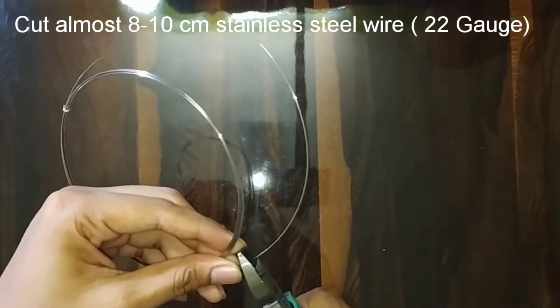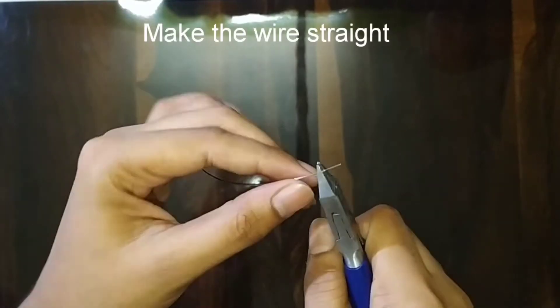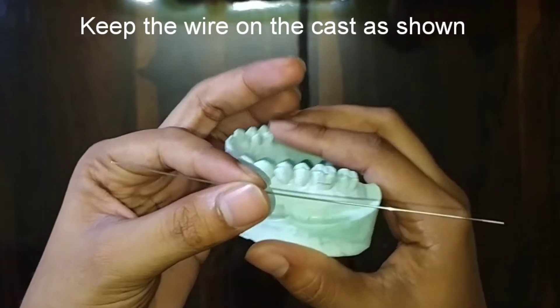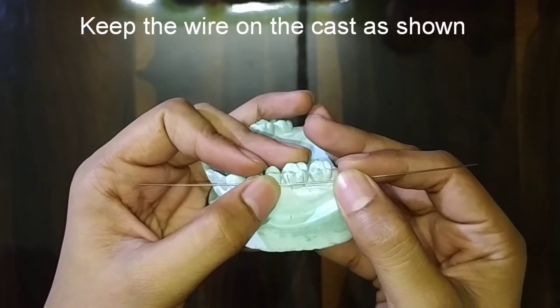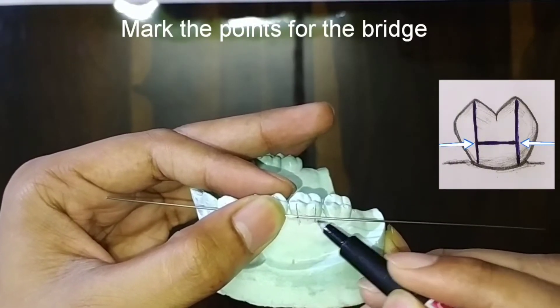Then with the cutter, cut almost 8 to 10 centimeters of 22 gauge stainless steel wire and make it straight as shown. Now hold the wire as shown on the cast and do the marking for the bridge.